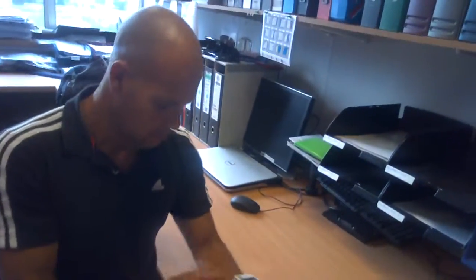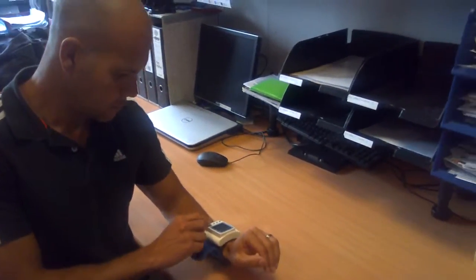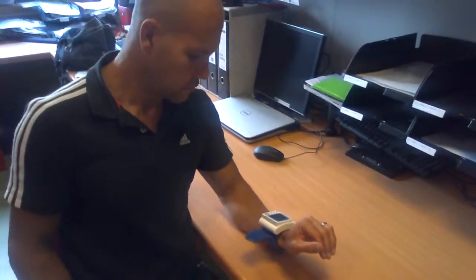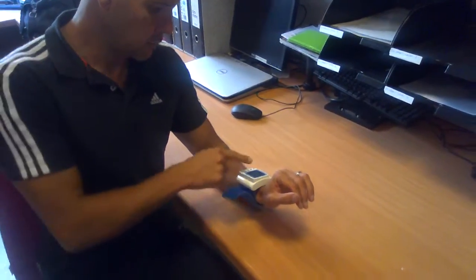And then raise your arm up to the level of your heart, keep it nice and straight and just press the start button. Okay? Yep.